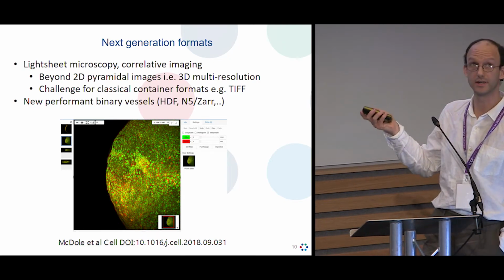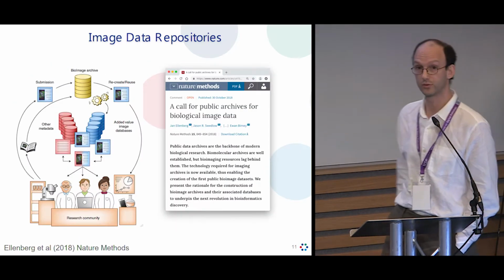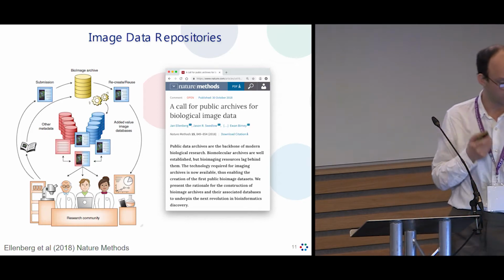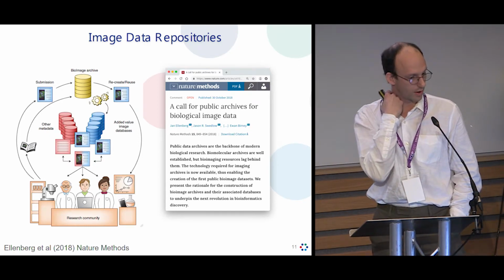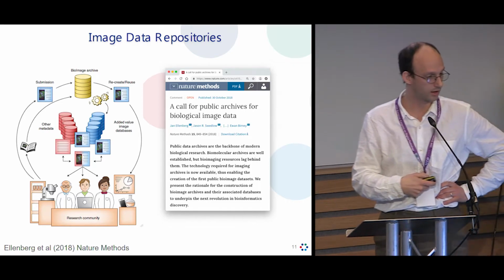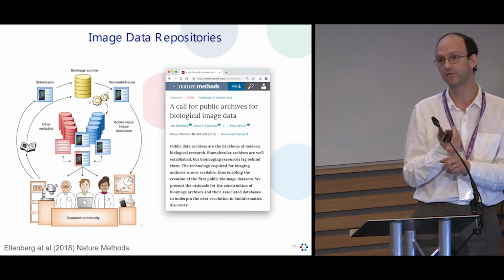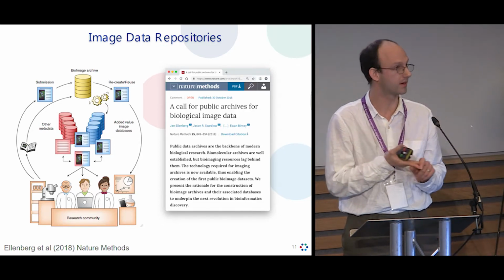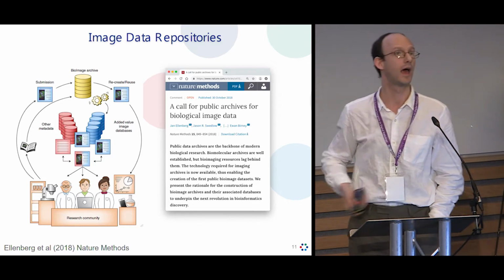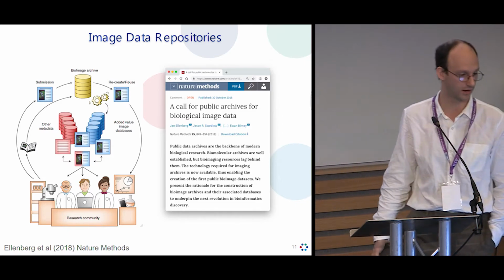In addition to, obviously, the open libraries and open formats I talked about, there's also something which is coming, which is open resources. So there's clearly new upcoming image data, new public repositories coming, which ingest public data, make them available via curation, via public archives, and make them usable for all kinds of purposes. So this is analysis, reanalysis, usage, or even training. We heard a lot about training today.